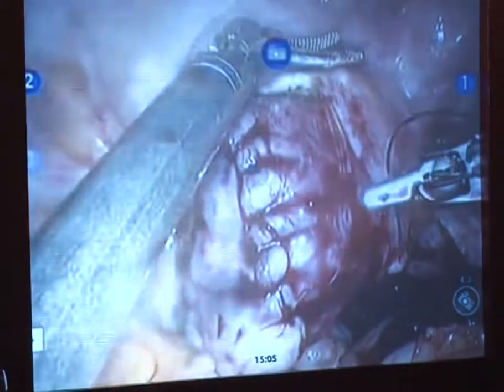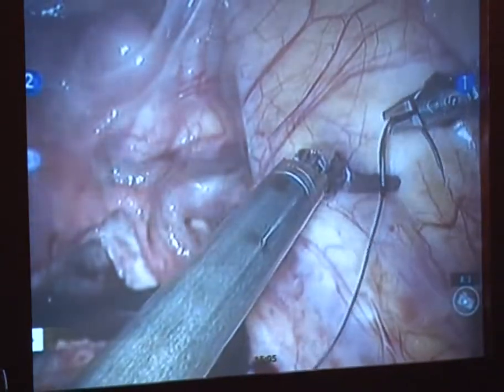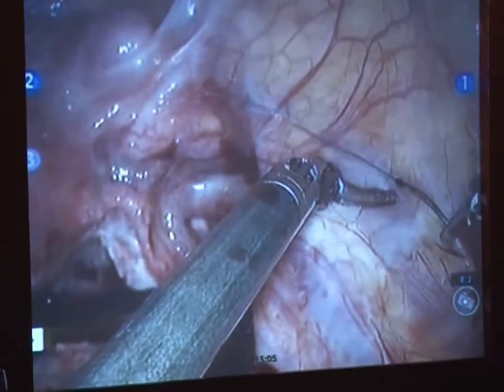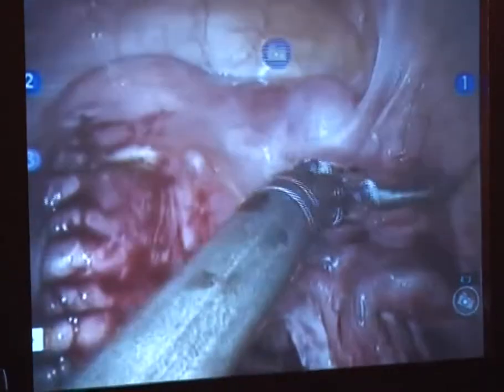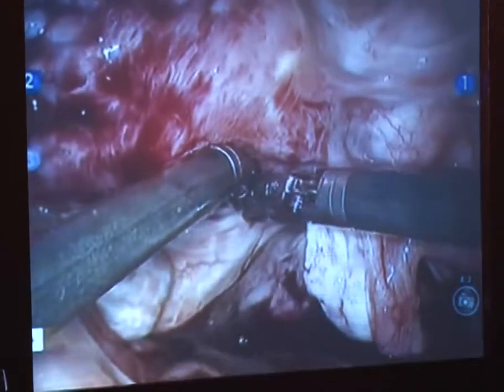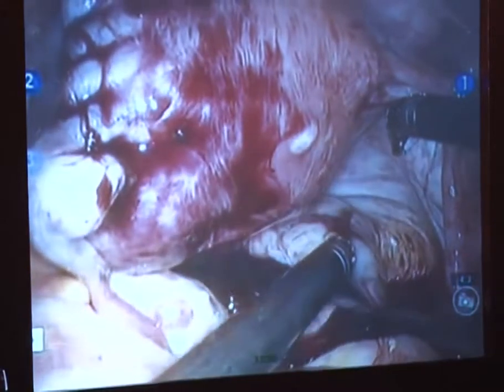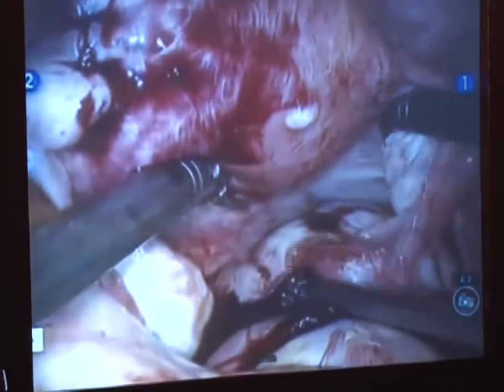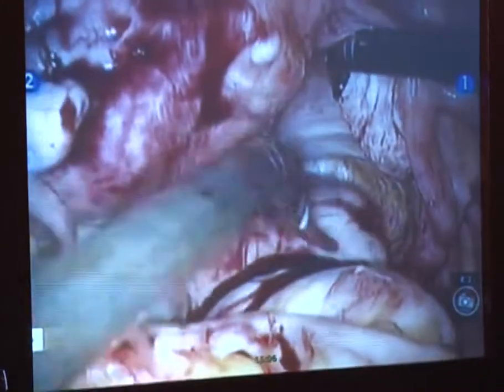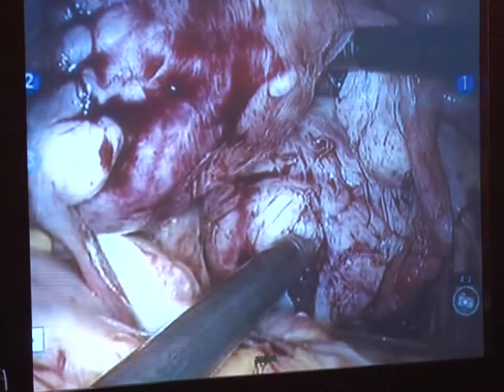I will need a scissor, please, where the needle driver is. Trying to get this oriented in a way that I can pull safely. I'm running out of space. So, can you drive the uterus a little bit more posterior than here?